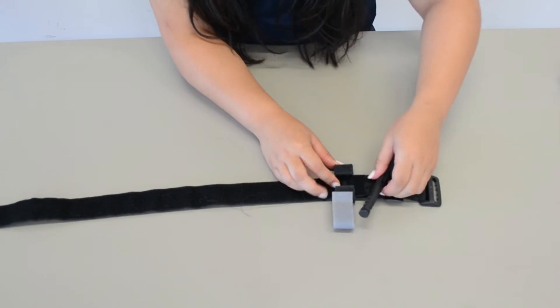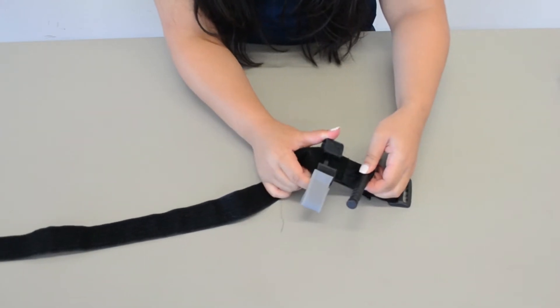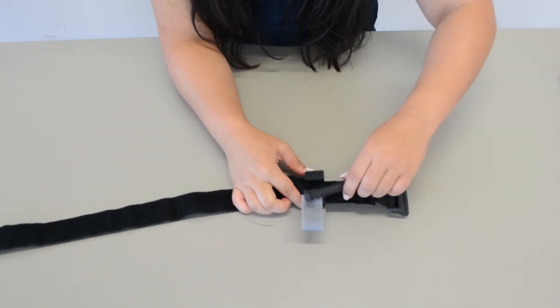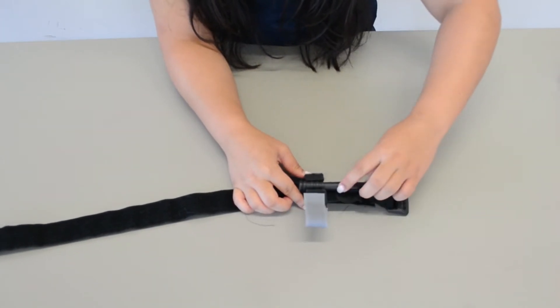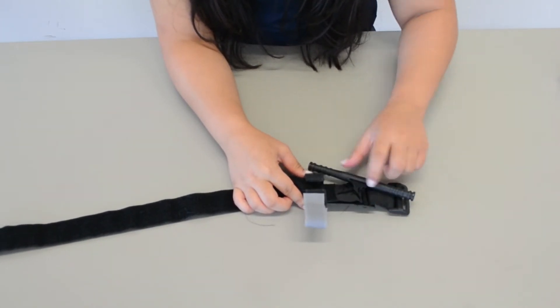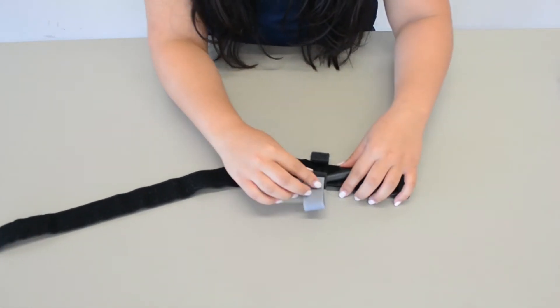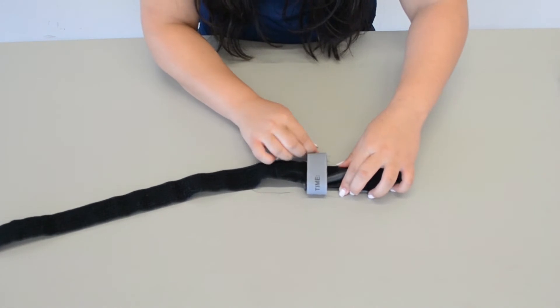After you're done twisting the tourniquet, you're going to go ahead and latch it on, just like so. You want to make sure it's latched — you don't want to leave it unlatched and have it unravel on its own. So you want to make sure it's latched right there, and then you're going to go ahead and write the time.